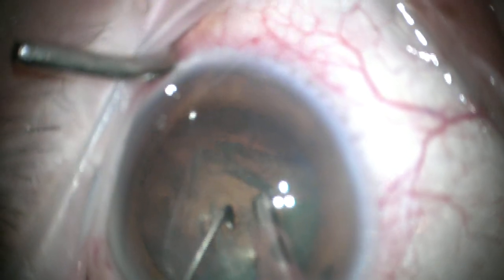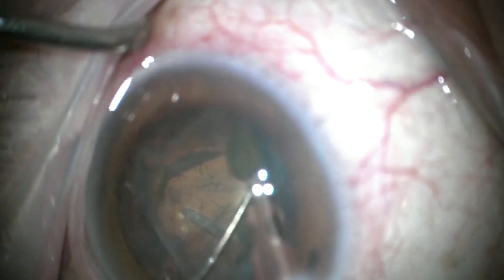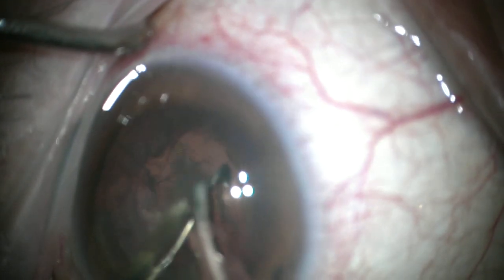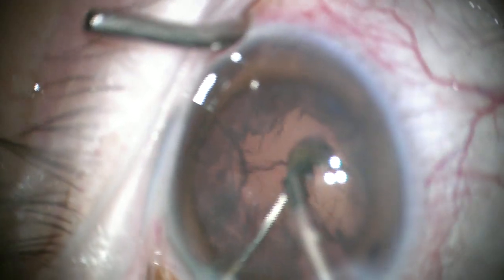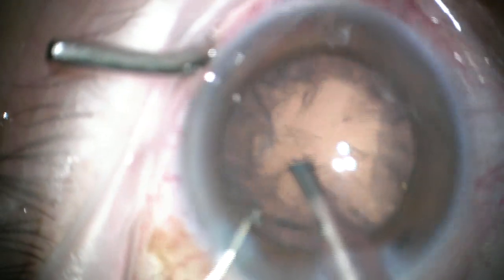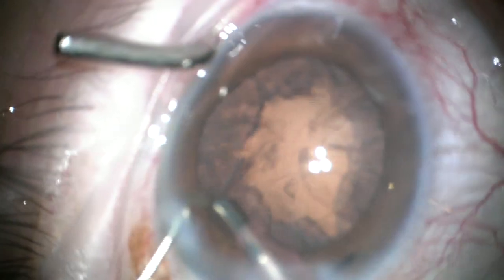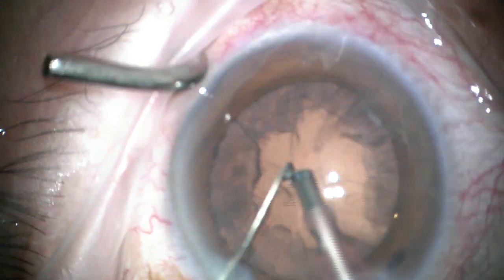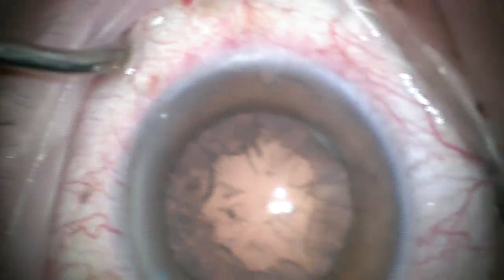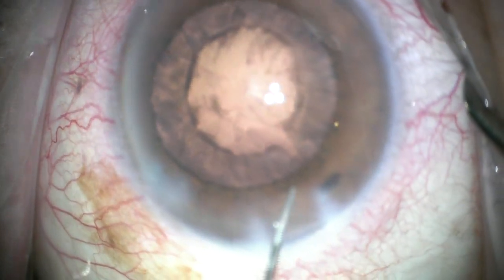One can switch to lower vacuum levels here, but if it's a stable chamber, I can just titrate back to less energy and vacuum with the foot switch and don't always need to switch down to the epinuclear settings. Notice I'm protecting the posterior capsule. Even though we have good instruments now that reduce surge, I still like to keep that second instrument under the tip. And look for fragments stuck by the paracentesis or the main incision before coming out with the phaco tip.